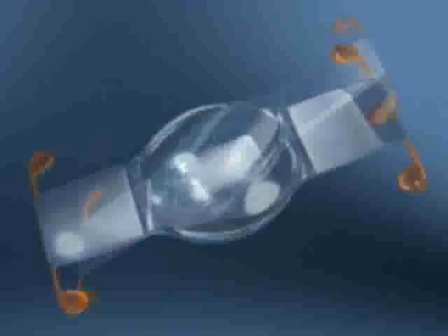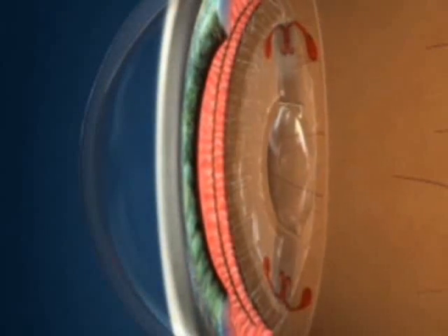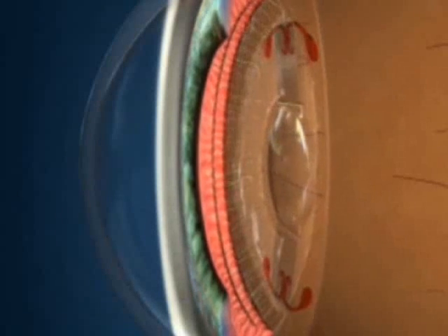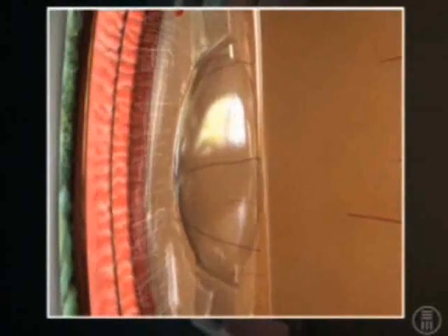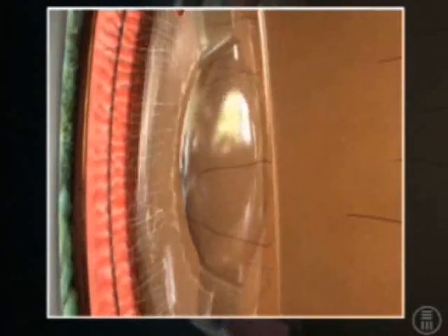Patients may choose to replace the natural lens with an accommodating intraocular lens. Like the natural lens, the Crystalens creates accommodation from distance to near vision by moving along the visual axis. Both the original crystalline lens and the Crystalens also arch or change their radius of curvature to increase their accommodation. They both move anteriorly and flex or arch to increase their focusing power in the intermediate and near ranges.